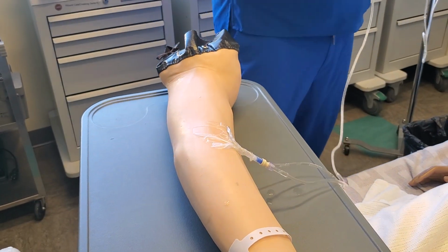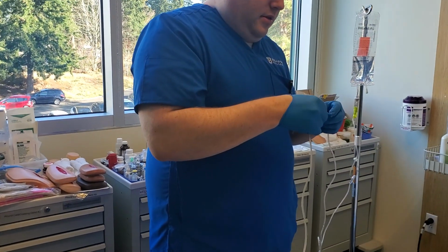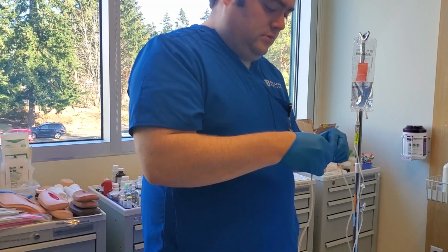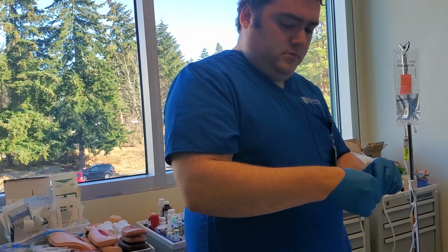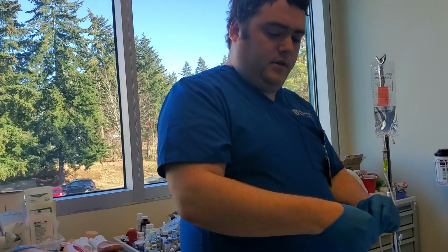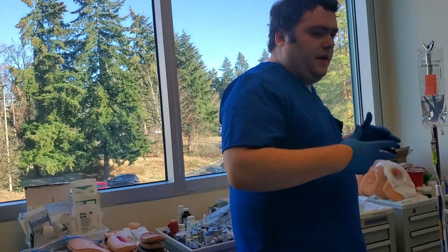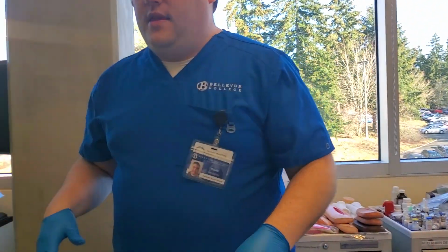Okay, then we'll go ahead and unclamp it here. That'll be moving. And now that we've got that done, move over to the secondary.